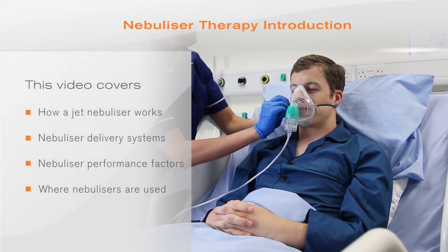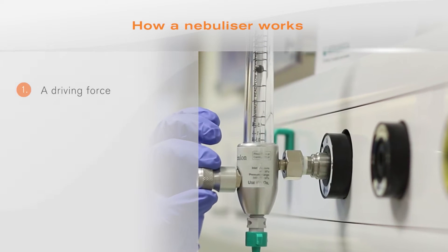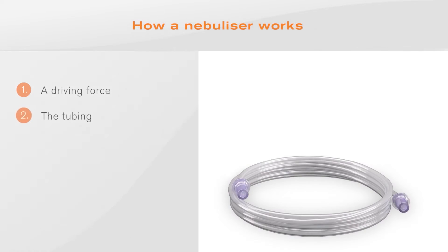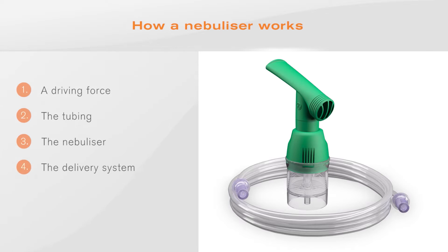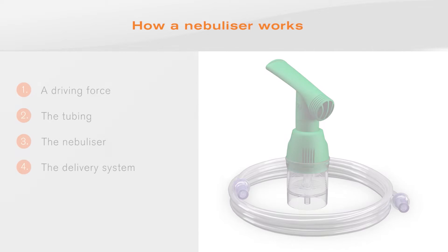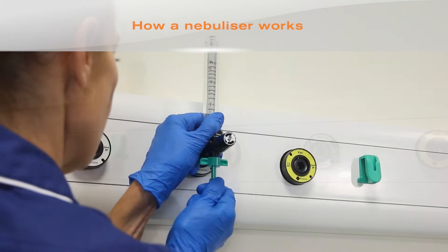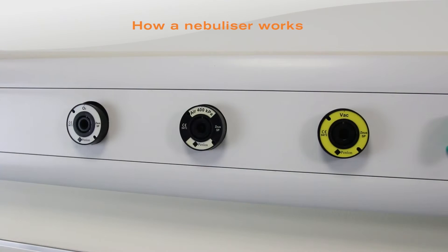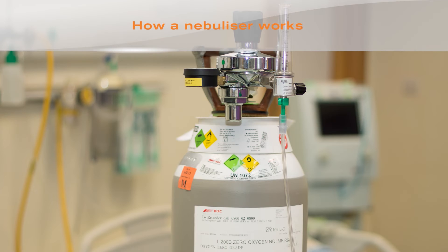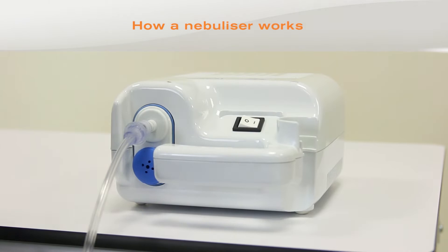A nebulisation system comprises four main components: a driving force, the tubing, the nebuliser itself, and the delivery system. The driving force is a supply of pressurised gas, which can be either air or oxygen, although oxygen should not be used if there are concerns about CO2 retention. Oxygen is readily available from hospital pipeline systems or pressurised cylinders. Air is most often supplied from a small, portable, electrically driven compressor.